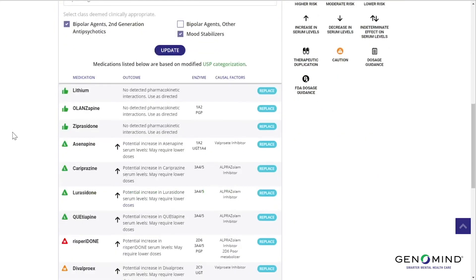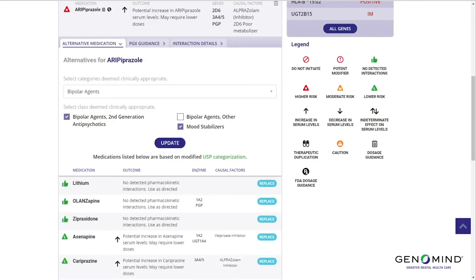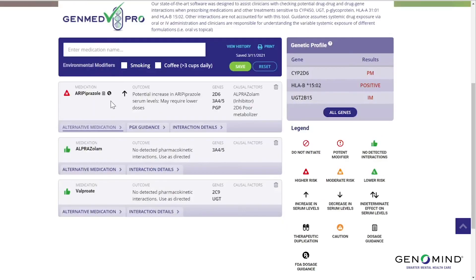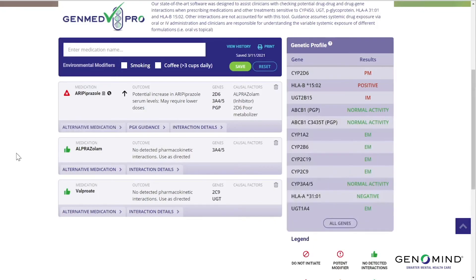We can also factor in our pharmacodynamic genes, in particular HLA-B*1502 and HLA-A*3101. These will help us identify those patients at higher risk of serious skin reactions with carbamazepine, oxcarbazepine, phenytoin, or lamotrigine. Watch what happens when we add lamotrigine to this drug profile.